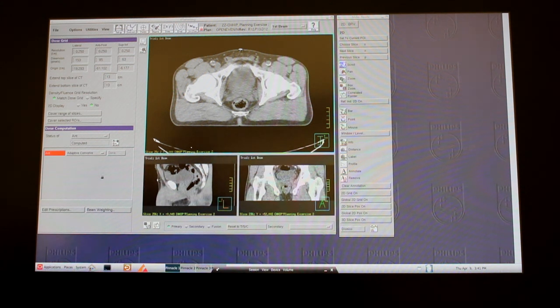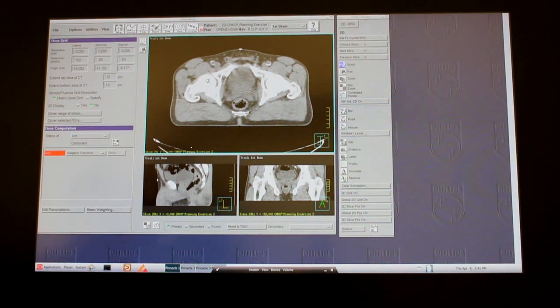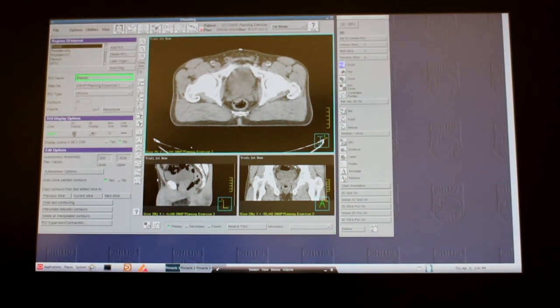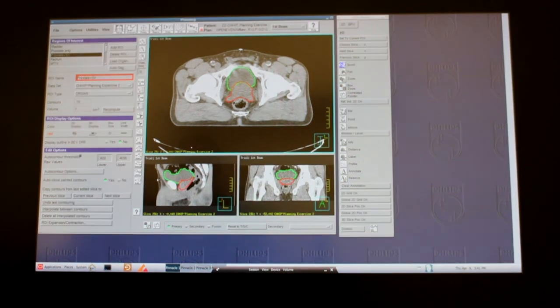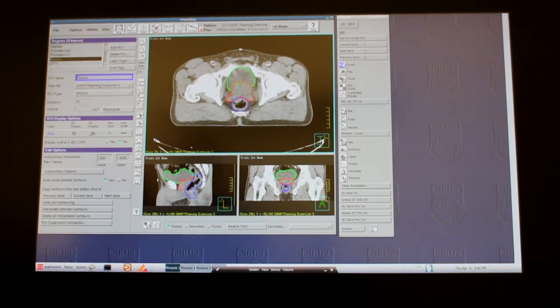Here we have a sagittal slice through a sample male patient, and here we have a slice through the pelvic region. This area here is the bladder. Here we have the head of the femurs where people sometimes have hips replaced. Down here is the rectum. The first job is to contour — draw all the structures that we want to avoid and the structures that we want to treat. We've drawn them already so I will just turn them on. We will have the bladder — that's the green one — and the prostate and seminal vesicles, and then underneath that we have the rectum in blue, which you can just make out abutting the back side of the target.